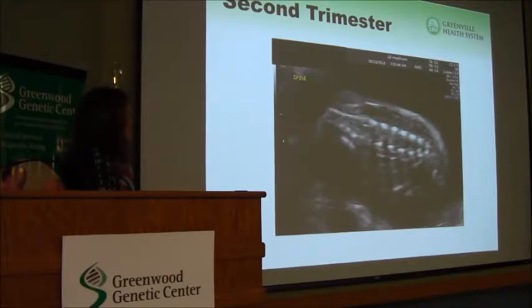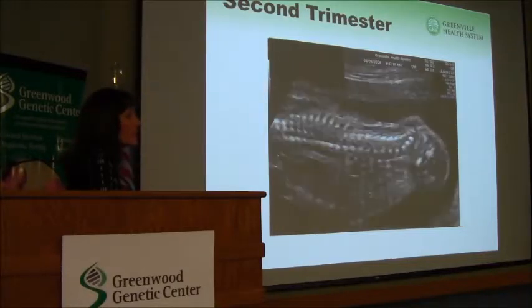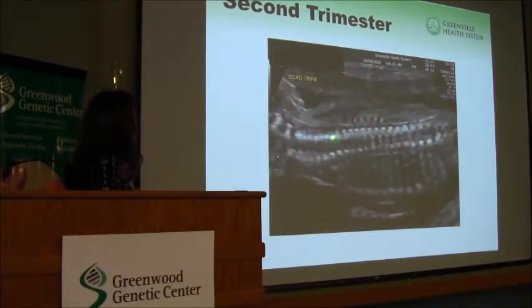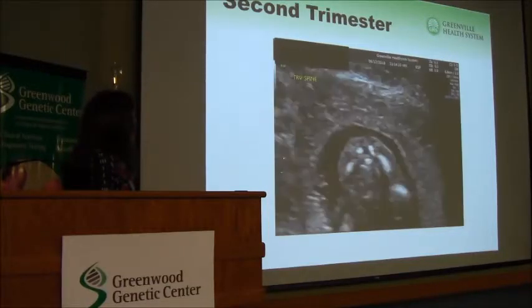So, neural tube defects. This is the lumbosacral area, which is the most common place for us to see a neural tube defect. And what we look for in the coronal view are these vertebral bodies that come down and then sort of point at the end. This is a normal lower spine. I had some really good pictures of the spine, so I may have taken too many. Here's one in a coronal view. When we do have a neural tube defect, we can actually count, these are ribs here, we can count exactly where it is and tell the neurosurgeon, hey, we think that the defect is from T4 to L4, so pretty detailed.